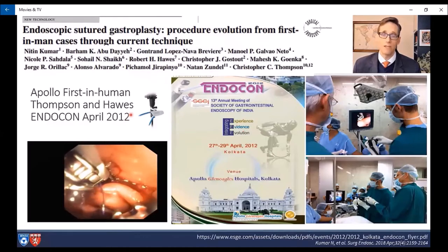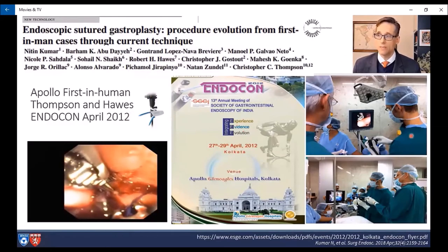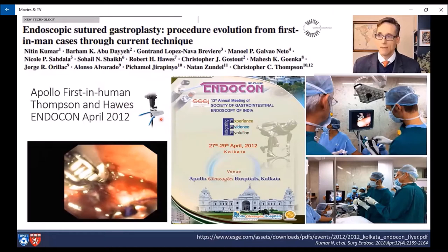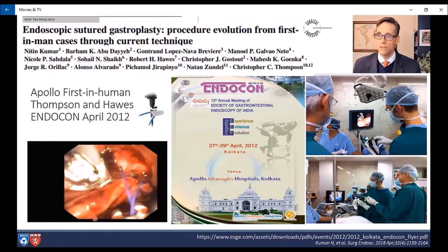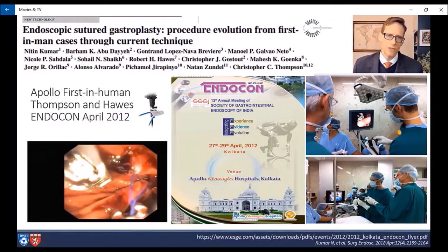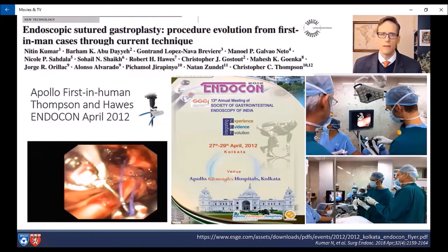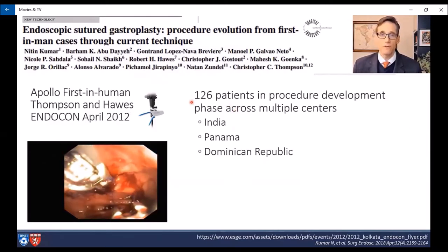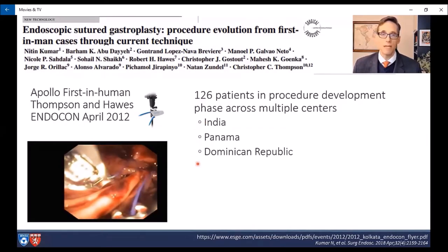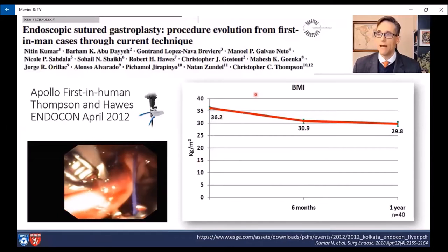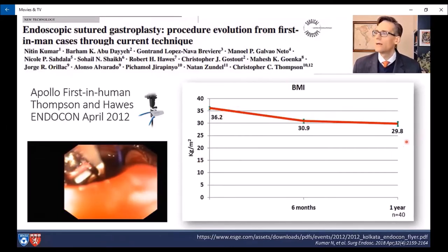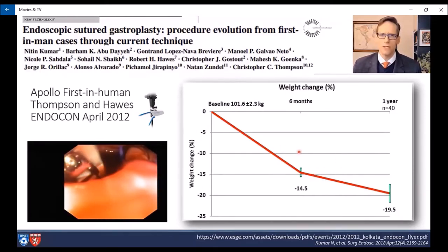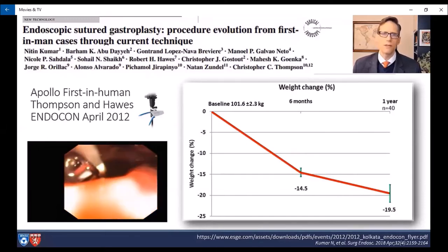In 2012, we had access to a full-thickness suturing device. Here you can see myself and Rob Hawes doing the first-in-man ESG cases, which we performed in India — we did one of the cases live at Endocon. The suturing pattern is very similar to that earlier procedure, again suturing down the greater curvature. We broadened this experience to 126 patients for the first-in-man study across several sites including India, Panama, and the Dominican Republic. The BMI decreased from about 36.2 down to 29.8, with about 20% total weight loss — much better than we saw with the partial-thickness suturing device.